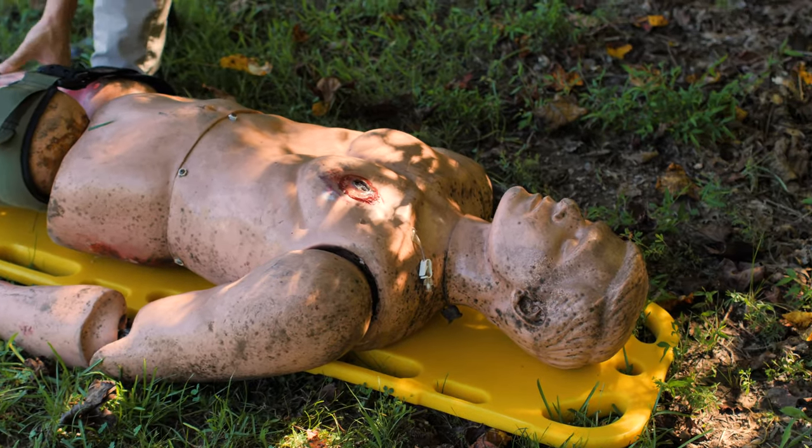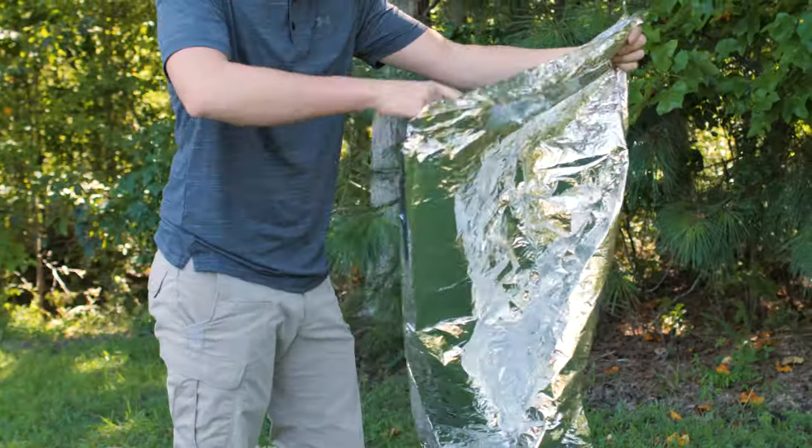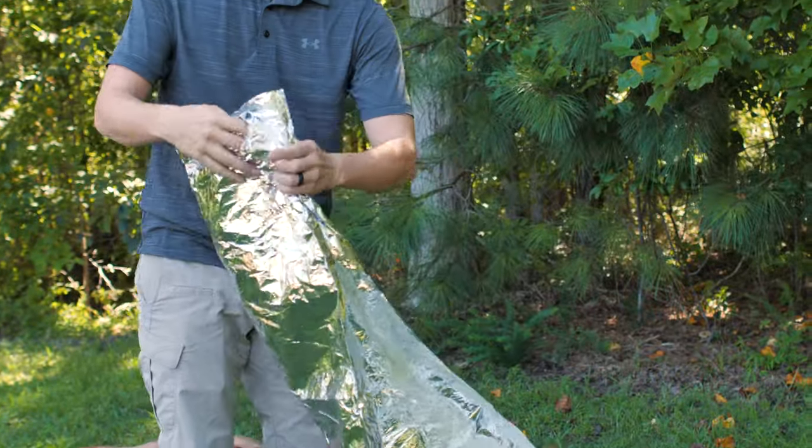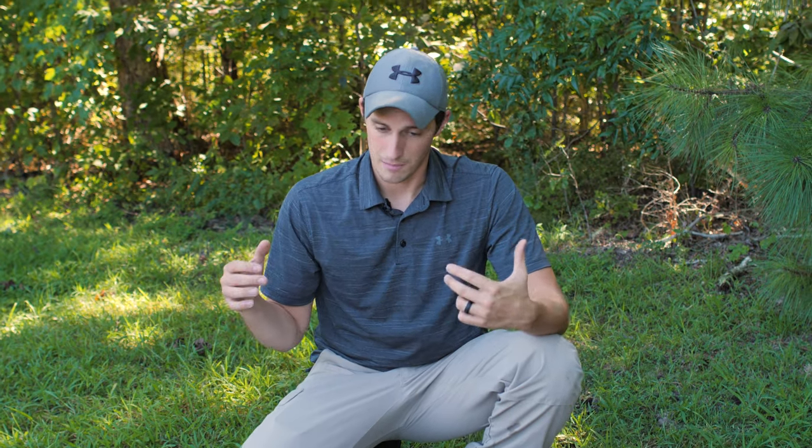Remember the point of a pelvic sling is to stabilize the pelvis. The SAM sling is a perfect economical way to do that. If you don't have one, another option is to use a blanket — fold it into a wide sling around the pelvic girdle and stabilize in place. A disadvantage is that you can't get this method as tight as commercial devices, so it won't work quite as well, but it's still a stabilization option. An emergency blanket can work, but it's easy to tear and you can't put as much force on it — a regular bed sheet or standard blanket works much better.